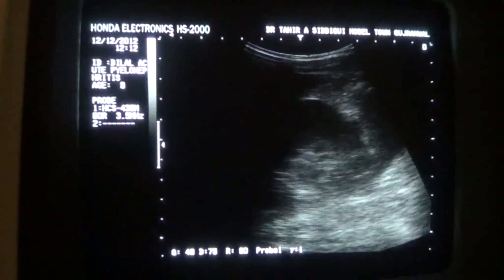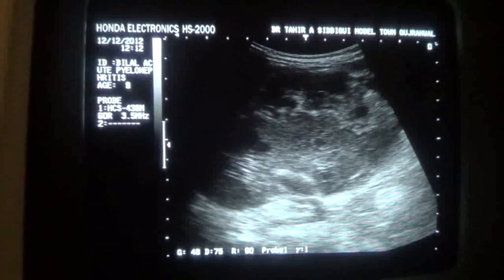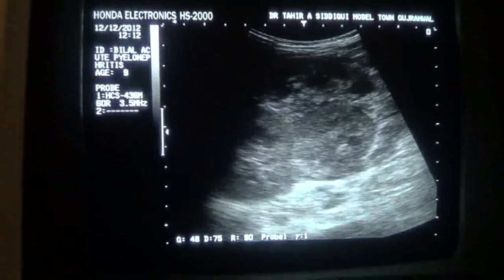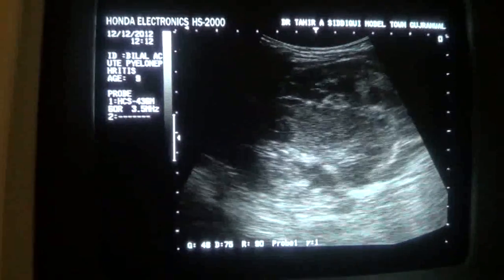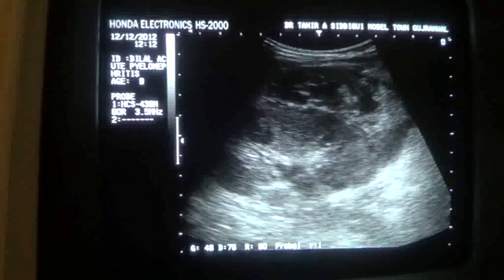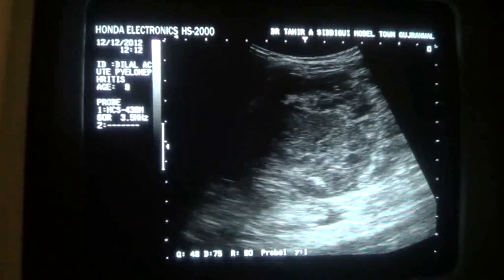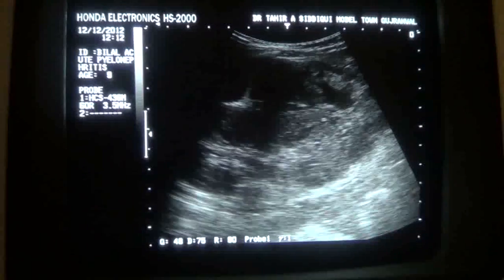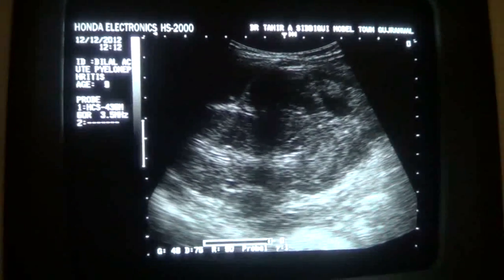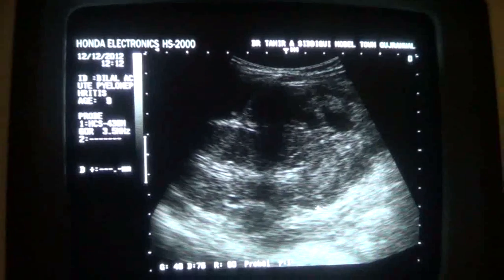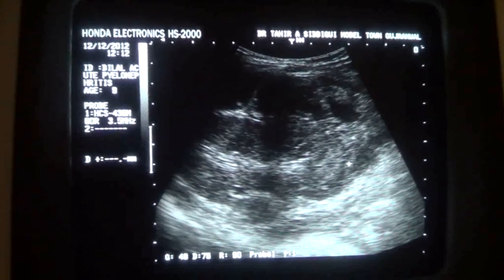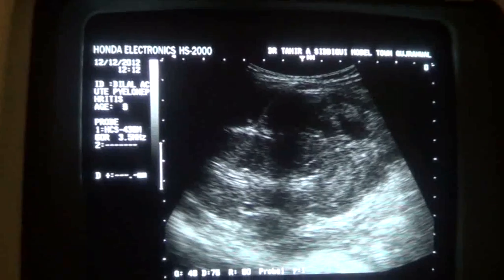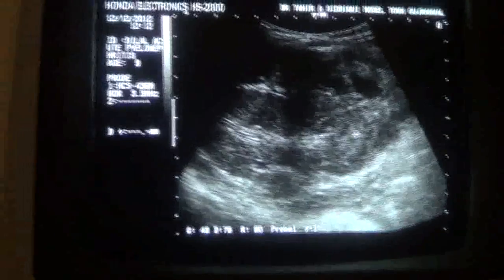Now this is a typical case of acute pyelonephritis. The central sinus echo complex is rather muffled — not completely, but is muffled. This is a typical picture of acute pyelonephritis. Here you see the capsule of the kidney, and you see fluid below the capsule at the lower pole — this hypoechoic area is the fluid. This is the capsule; this is the fluid — hypoechoic fluid.